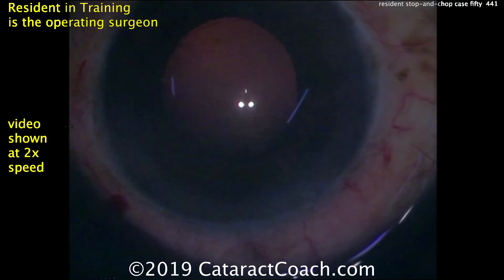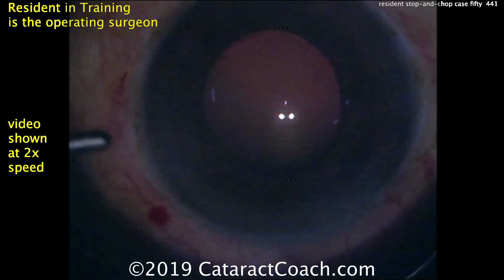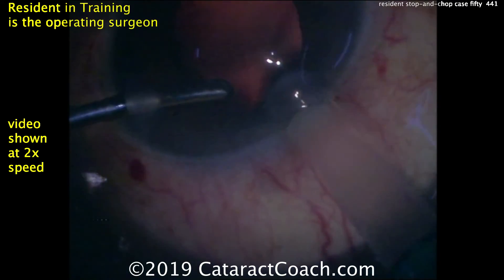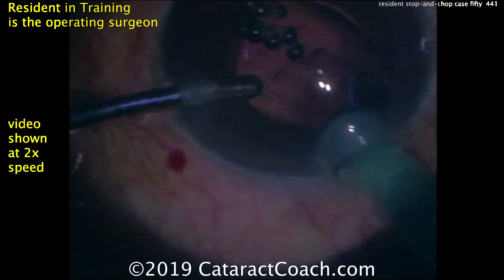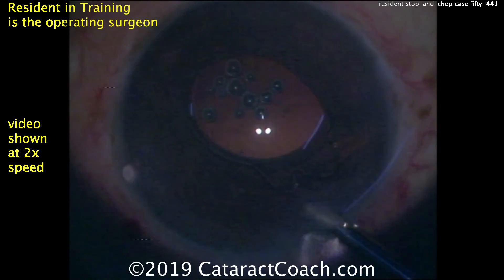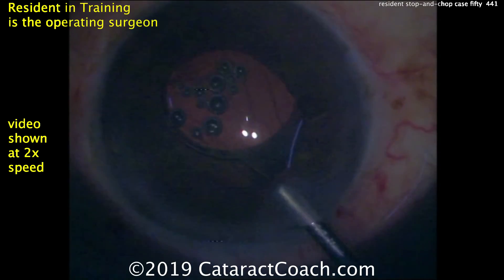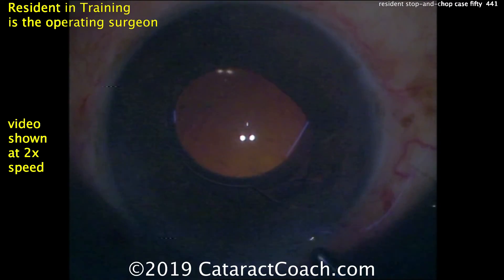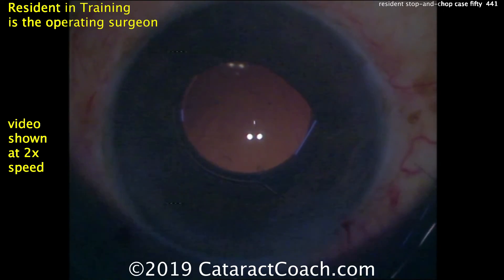Infusion is going in the eye and here comes the injector. The IOL is being injected without extra viscoelastic — in fact just with the infusion holding open the capsular bag. This is an acrylic lens — looks like maybe a hydrophilic acrylic. This particular lens design I don't think is available in the USA. I still see one haptic above the iris, so we need to fix that.